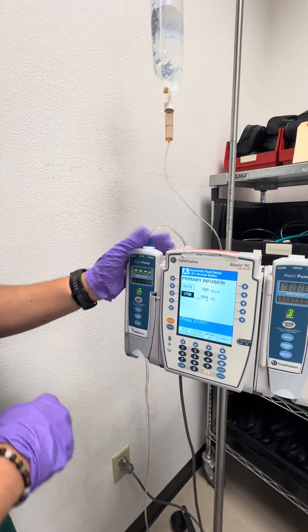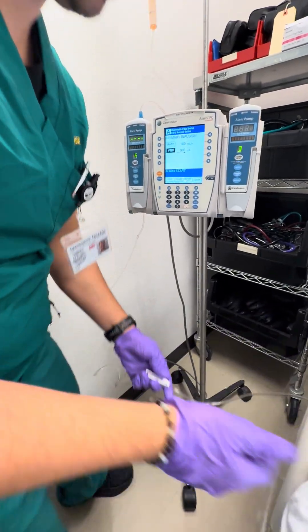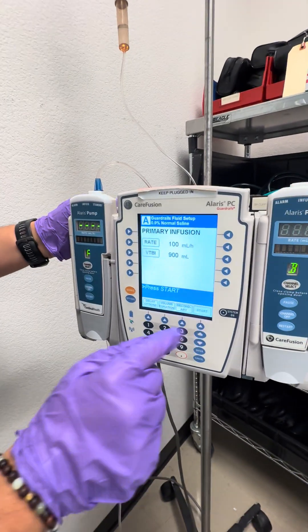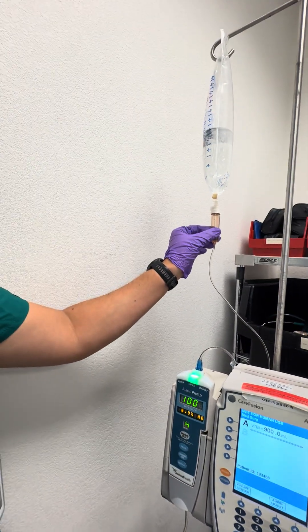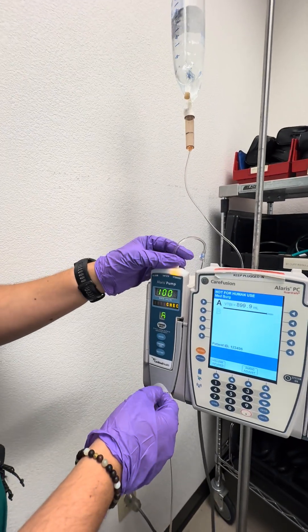We unclamp the line and press start so the normal saline is now infusing. There are some bubbles in this line which may trigger alarms, but the medication is running.